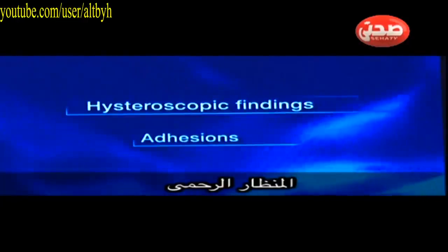Adhesions are also another important finding of hysteroscopy, especially for ladies with a history of hypomenorrhea or thin endometrium on ultrasound scan, and also a history of previous D&C.